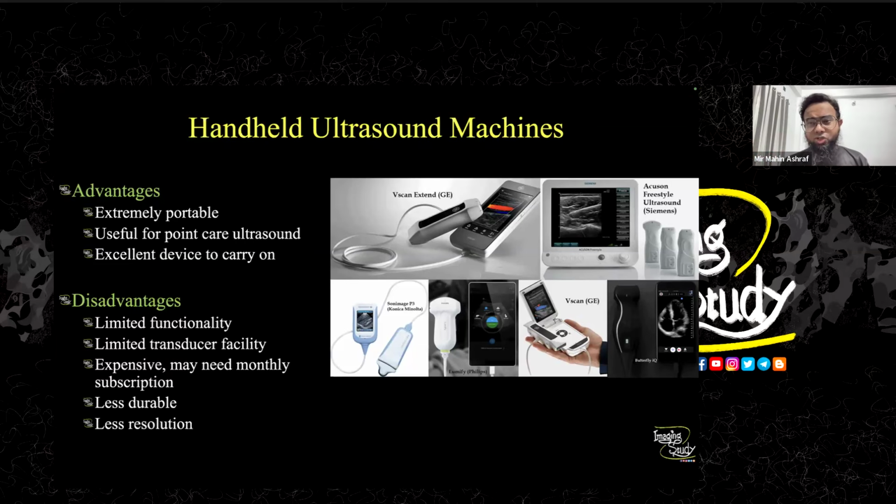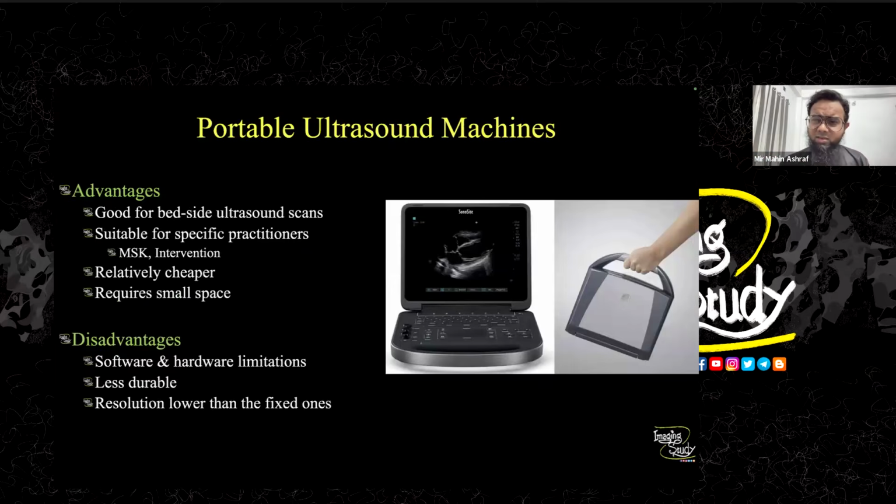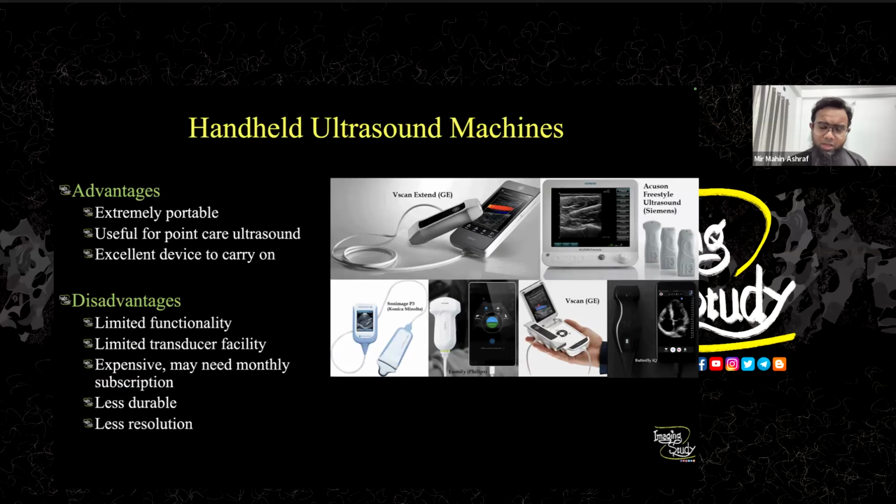Okay, it's still less durable, and obviously the resolution is still not very satisfactory in comparison to other ones. Like with this machine price, you can obviously buy a very good portable machine. So that makes the market very loose, and hopefully it will get upgraded soon.